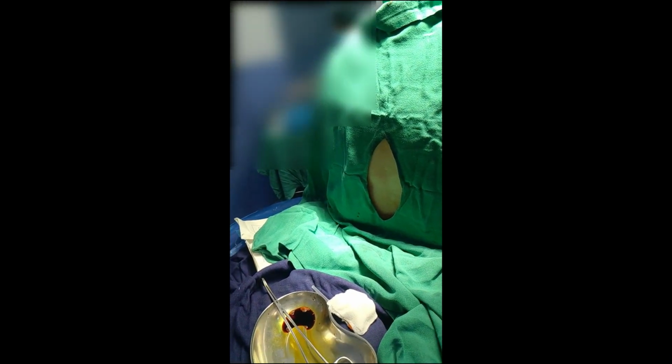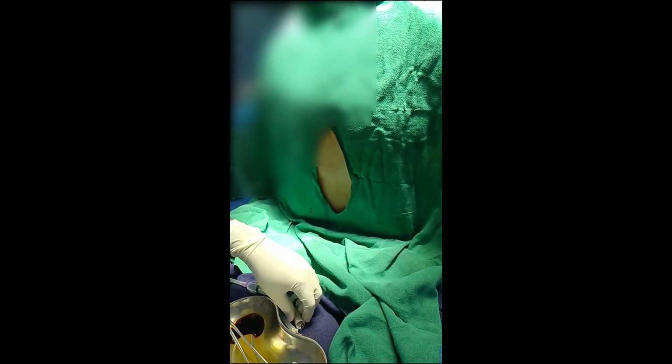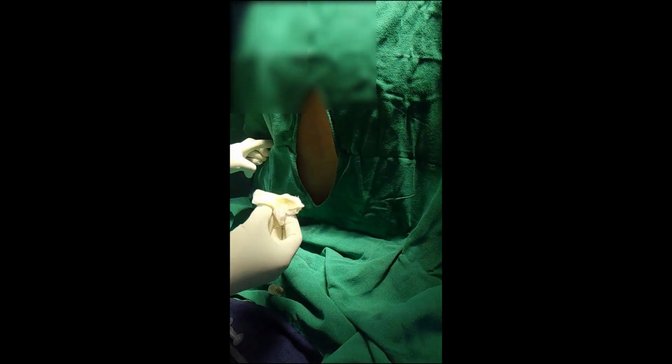I have already loaded the drug. It's a 0.5% hyperbaric bupivacaine solution, and for the C-section I am using 2.2 ml. Now let's wipe the skin.